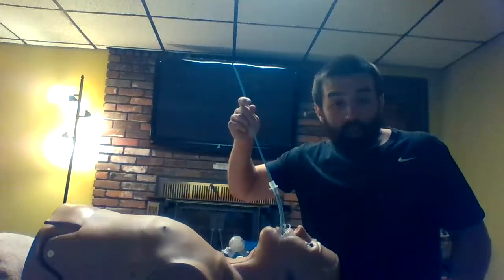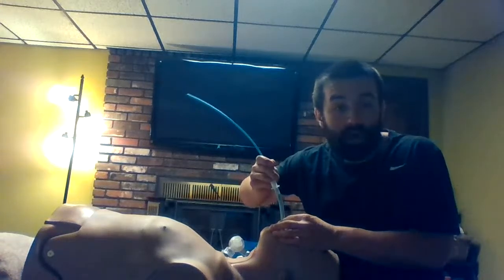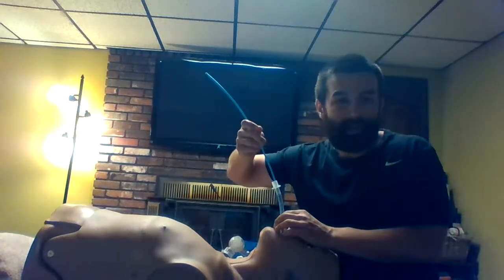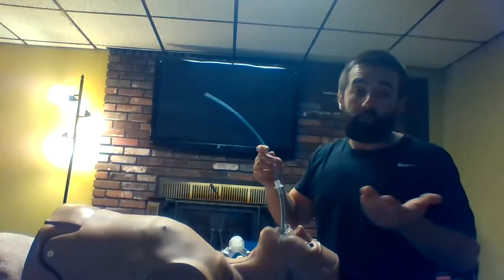So at this point, this is where it gets tricky. You need to keep this thing in place. You don't want to advance it too far and jab the carina because it could cause them to brady down and cause a lot of other problems. Likewise, we don't want to come out too high. Otherwise, we might lose that guide wire and need to be able to re-intubate these patients fully. We still need to be prepared for that and have our airway cart and everything, but hopefully all we're going to do is pull this tube out and put a new one in.